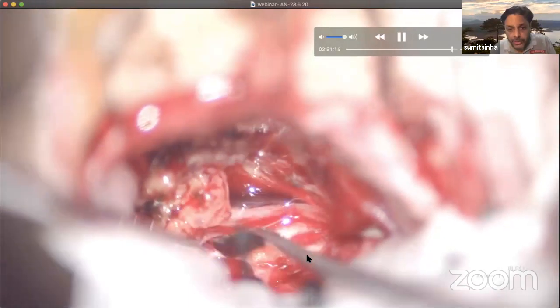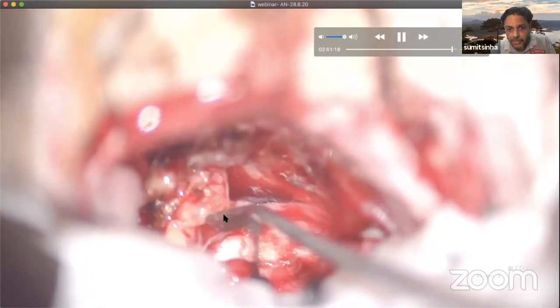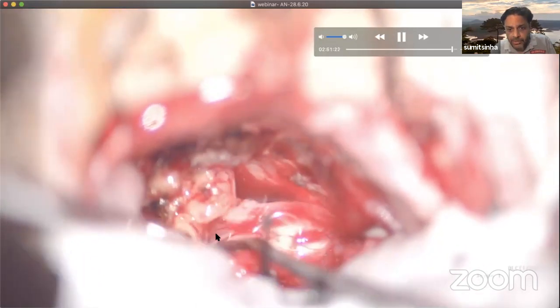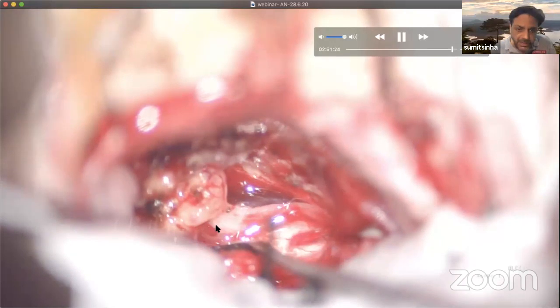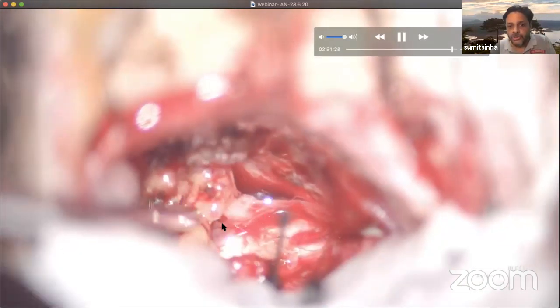See, there is no arachnoid between the facial nerve and the tumor capsule. You see that? This is my hypothesis. The arachnoid is here, which is outside. The facial nerve is inside the arachnoid, well opposed to the tumor capsule. So you have to be very cautious always.